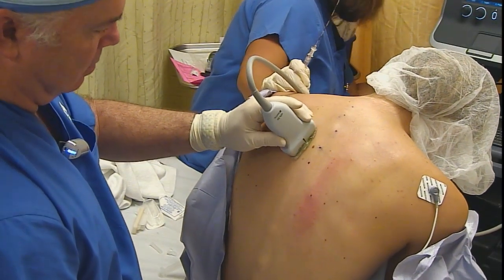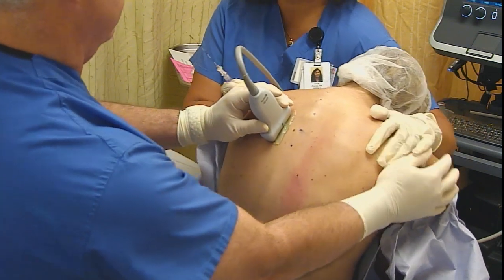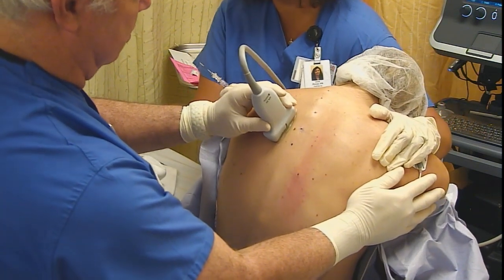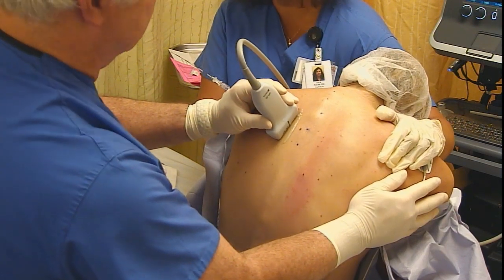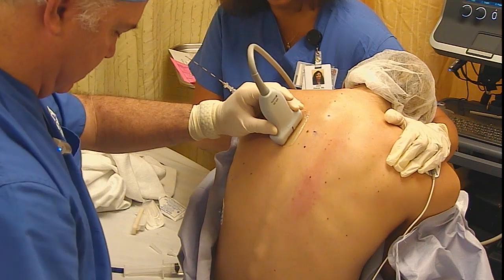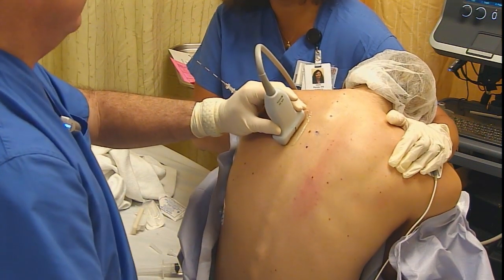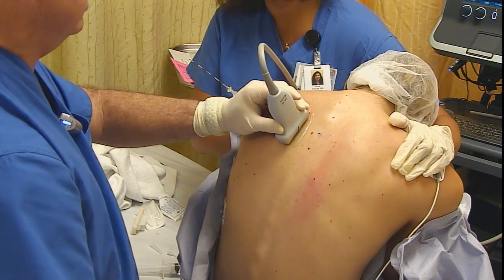Doing thoracic paravertebral blocks here. You can see we've marked off C7 through T4 and we're going to go with the T3-4 level to do this first paravertebral block. We're getting our image where we can see it best, lining up our probe just lateral to the midline.